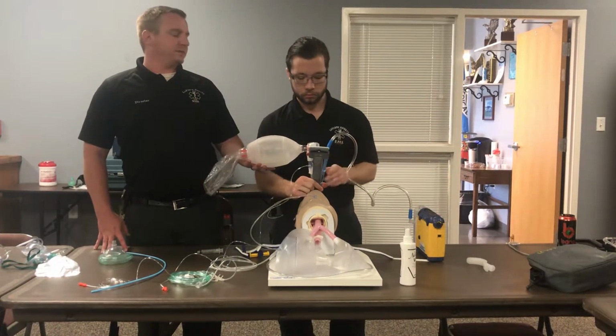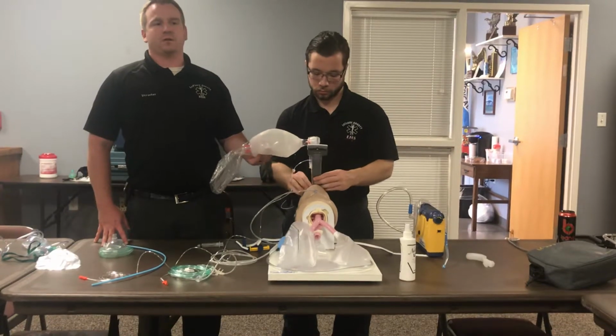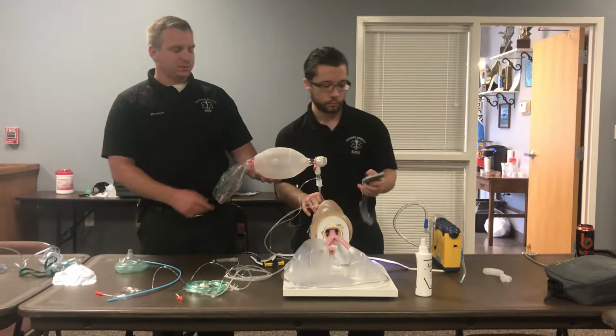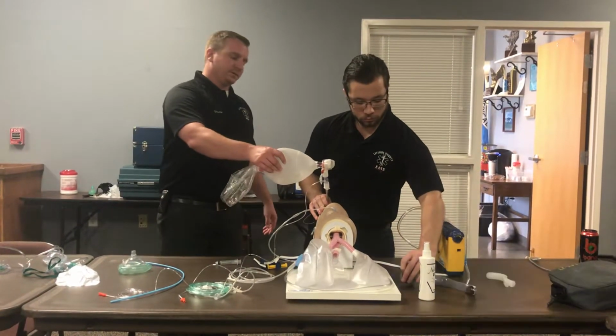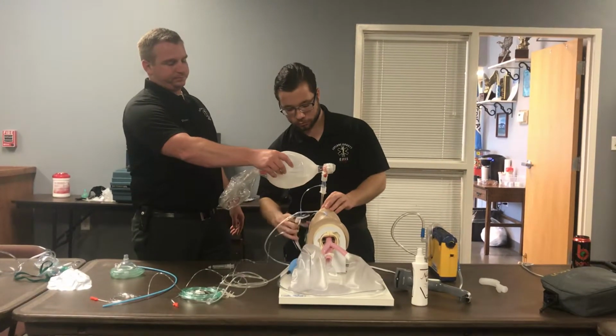So he can turn that off now. We can remove the suction device. If we need to, we will put soft catheter suction down the tube. He's never going to let go of this tube. This is his tube, and he wants to make sure it maintains. He's going to secure it.